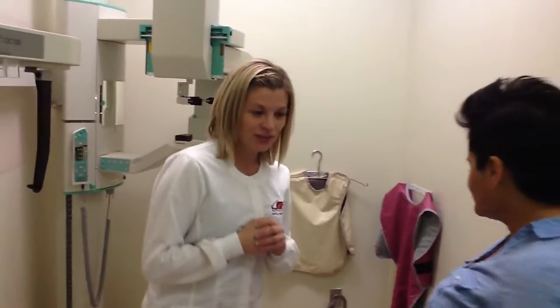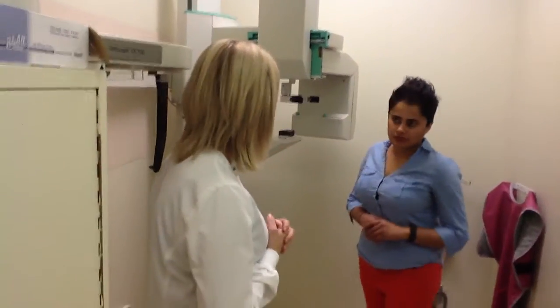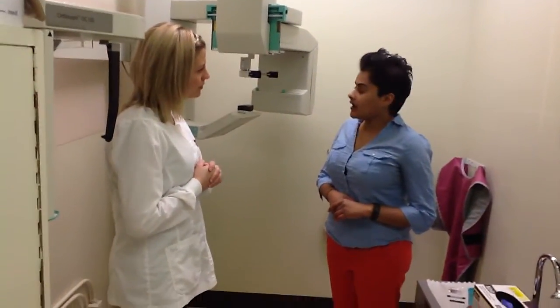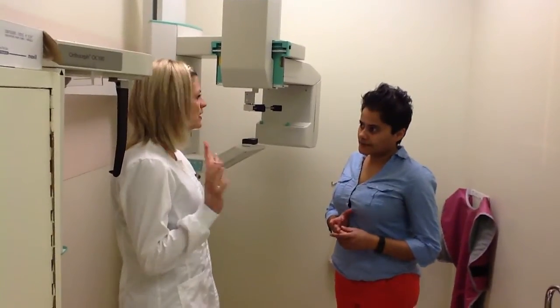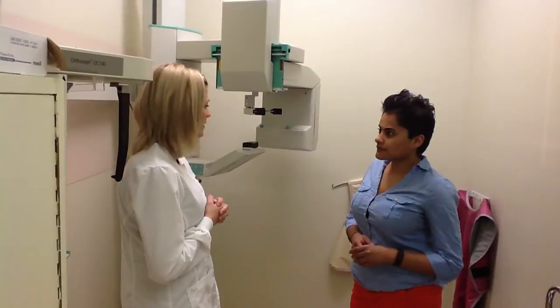Hi there, how are you? Hi, good, thank you. Yourself? Great. So Dr. Sate asked me to take a pan for you today. Okay. So have you had a pan before? No, I have not. Okay, so I'm going to tell you a little bit about it before we begin, so you have an idea of what's going on and why we take them.